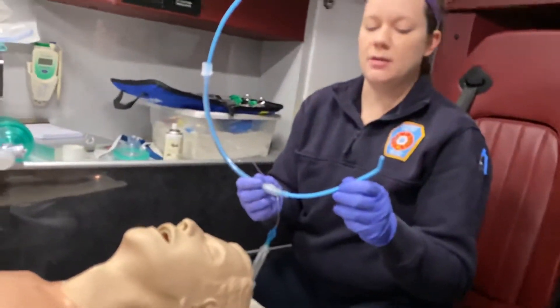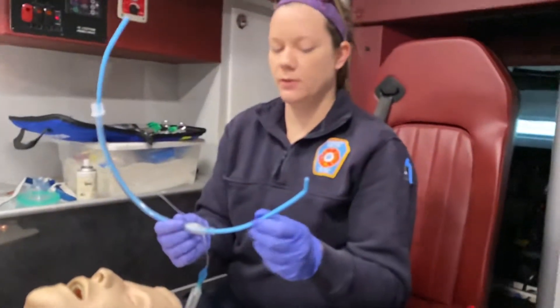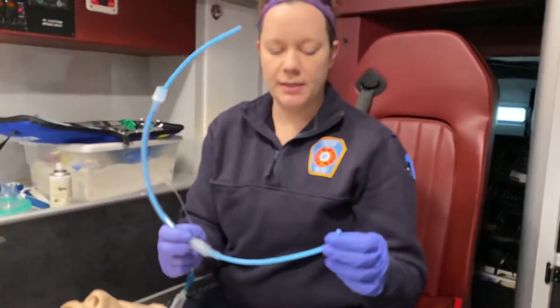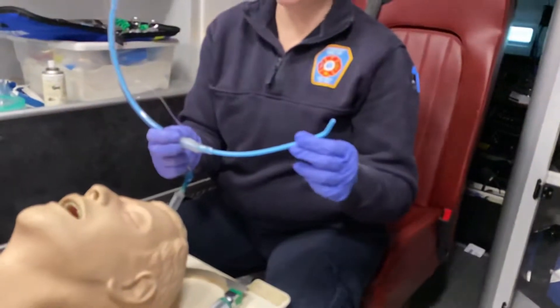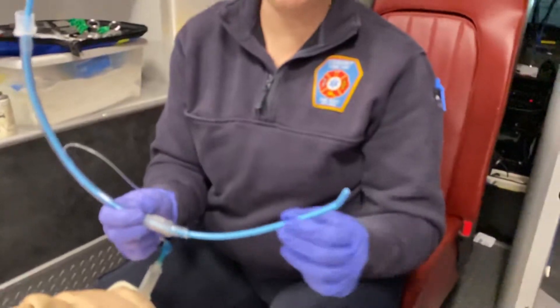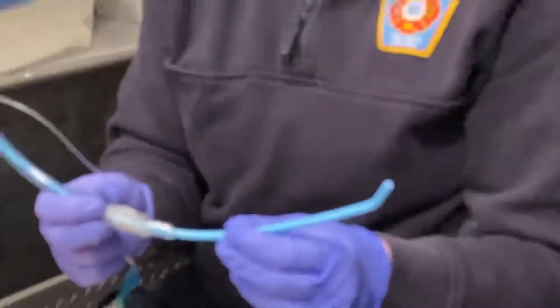I'm going to demonstrate the bougie device — the gum bougie — which is a tube introducer that can help with intubation. I like to use these on patients who have a hard time visualizing their airway, such as our obese patients and our patients with short necks. This is a very good tool we can use to help intubate our patients.